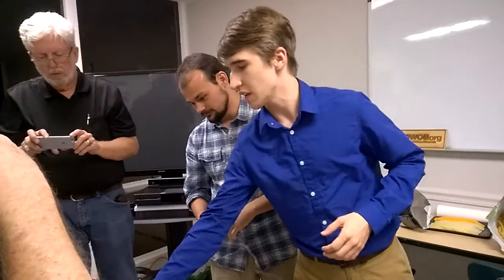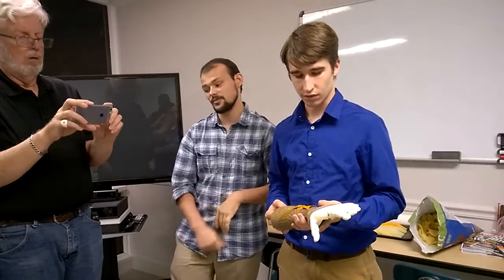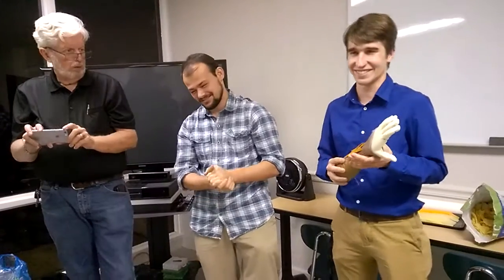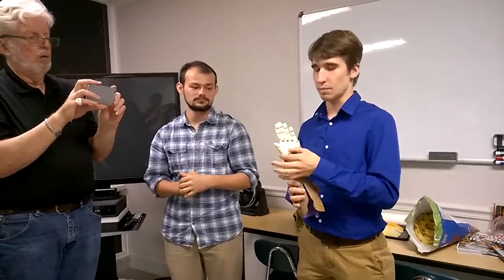We're actually giving this arm to her this weekend — day after tomorrow. She has not yet seen it, but she knows about it. She's six. We developed the previous one for Alex Pring with an eight-week design window. This one was two weeks — but we already had that one under our belt. The hand is almost the same, just modified slightly on the thumb.